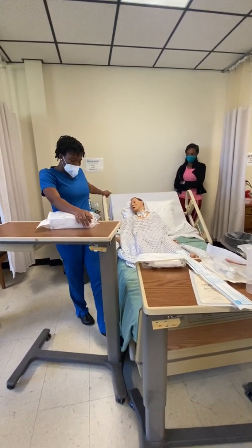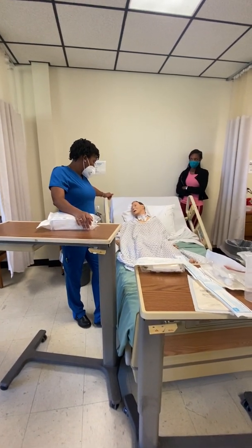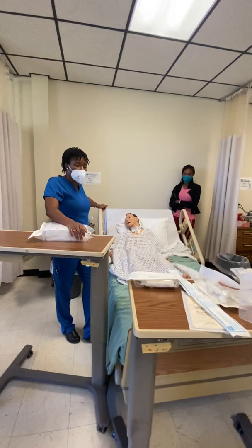Okay? So we're gonna wash our hands, we're gonna go to the room, and we're gonna tell our patient, hi, Miss Jones. My name is Miss Fortin, and I'm scheduled to do a catheter on you today. Your bladder's not draining well, so the doctor ordered one for you.